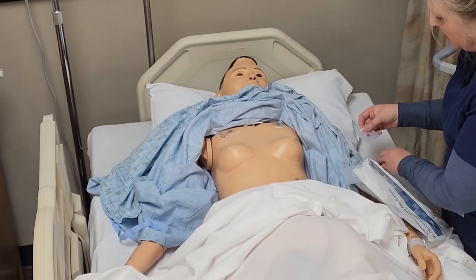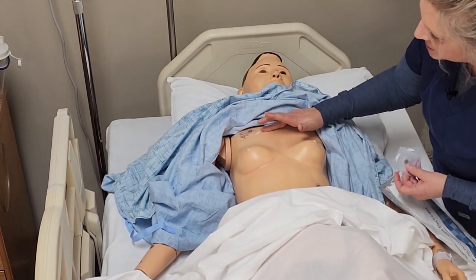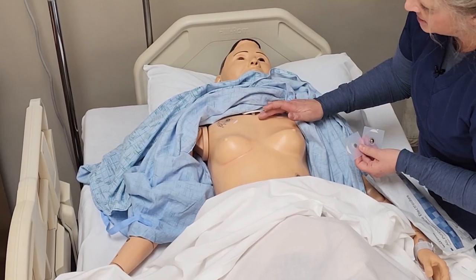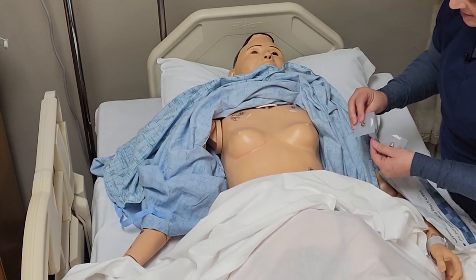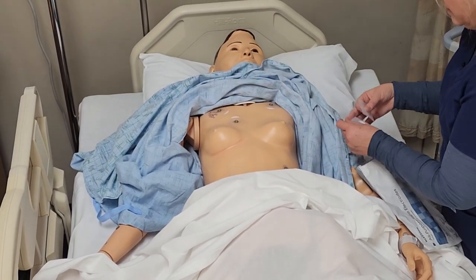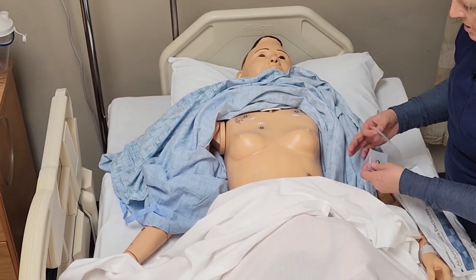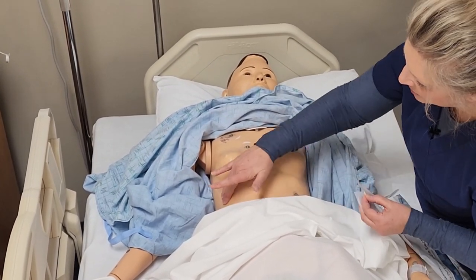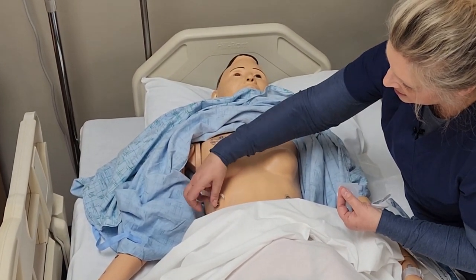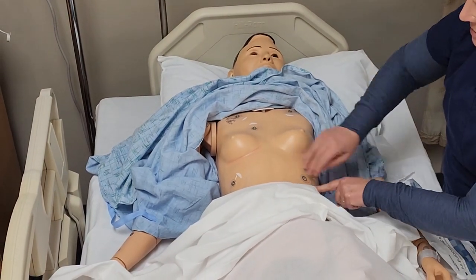Then we're going to go into the fourth intercostal space. We're going to try to find our fourth intercostal space and do that on the right side of the chest. Then we're going to do our lower ground, right below the rib cage here, and then the other one on the right side below the rib cage at the distal end of the rib cage.